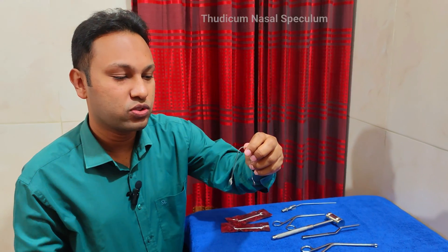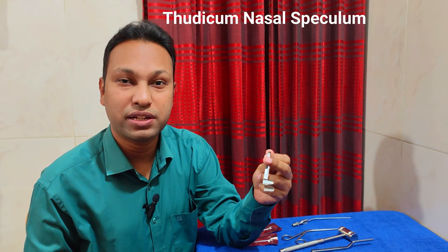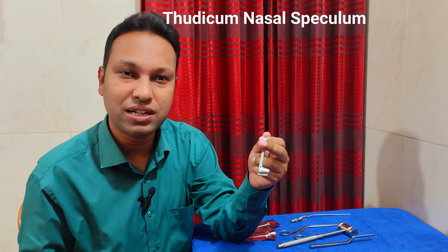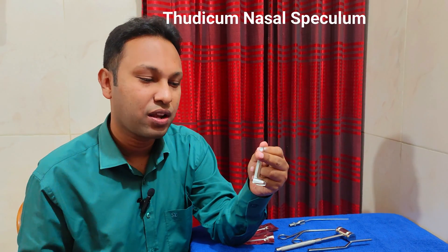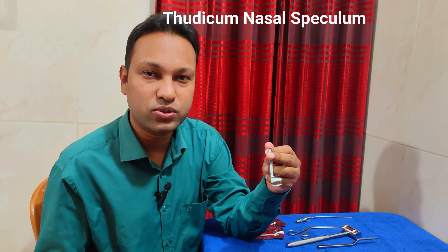The Thudicum nasal speculum is used for anterior rhinoscopy. We use it in the beginning of septoplasty operation for inspection, for giving suction, for giving decongestant drops and packs, and also it helps us to give the injection of local anesthesia and give our first incision over the nasal septal mucosa.